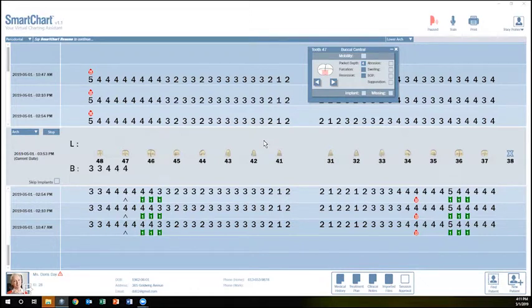So one of the things that we encourage is we can do a single pass and record all of the conditions. I spent a lot of years, 17 to be exact, in a periodontal practice. So, charting, we were using furcation probes, of course, to chart our furcations. In this case, with a class 1 furcation, you can easily do that with your probe. So on a single pass, you're going to feel that furcation. You can pop it in at the same time. But in some cases, you're going to want to go back, pick up your furcation probe, and probe all of your furcations on a second pass. So I just wanted to pause it to show you that that can be done as well.